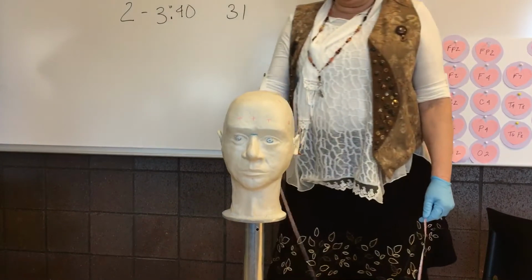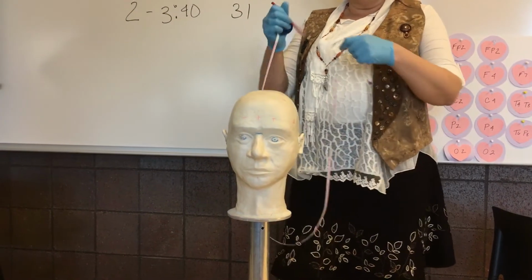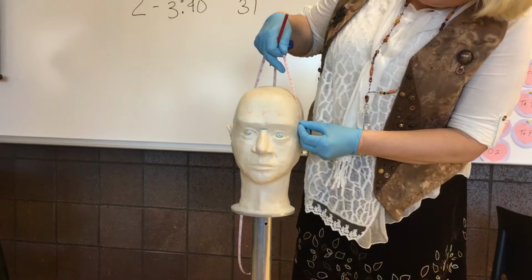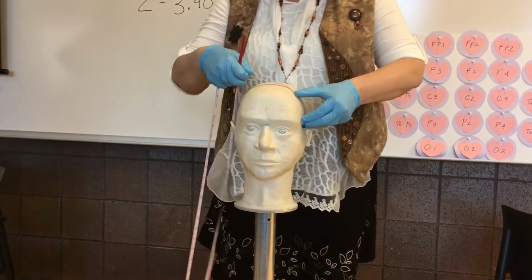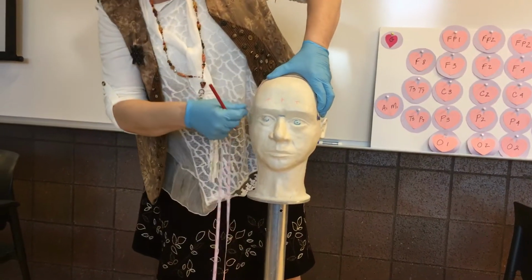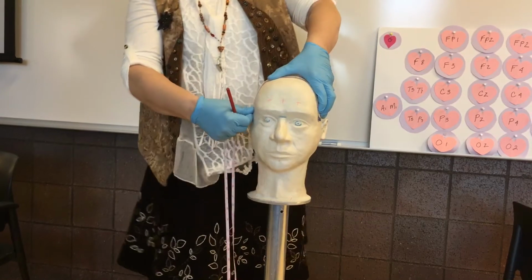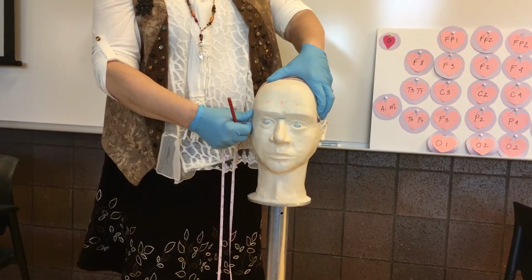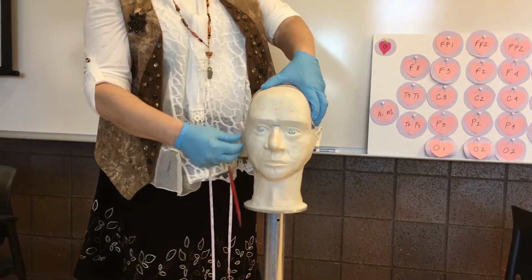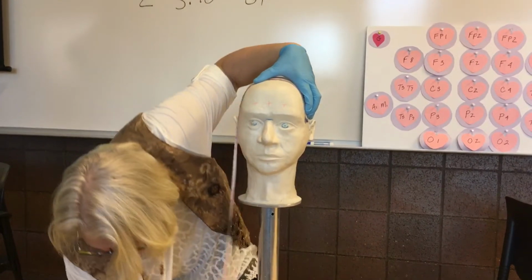Horseshoe, and in the back around, like a horseshoe. So, we're going to put our 0 here, go behind this one, behind this one, behind this one, and over to here, and I get 23. What's half of 23? 11.5. I dropped my pencil again.